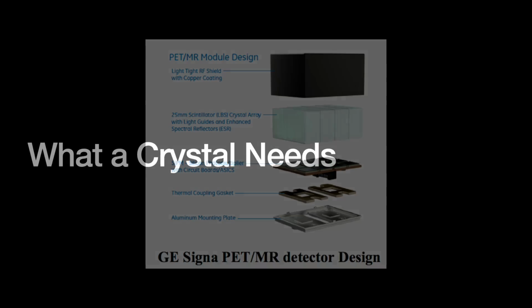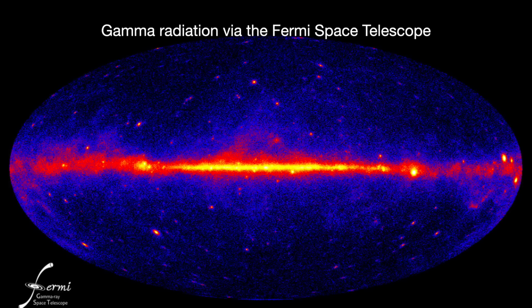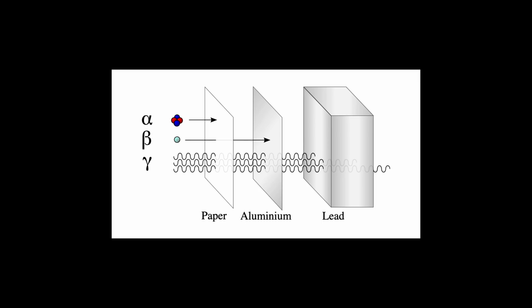In order to be suitable for a PET scanner, scintillation crystals have to have several special requirements. First, they have to be really good at stopping and interacting with these gamma photons. This is in large part determined by the material's density. The higher the density, the more probable it is that the photon collides with an electron and triggers the photoelectric effect, a probability referred to as the photoelectric fraction. Dense is good because it is pretty likely that these photons pass right through the crystal. These crystals' photoelectric fractions for 511 kilo-electron-volt gamma photons are universally less than 50%.